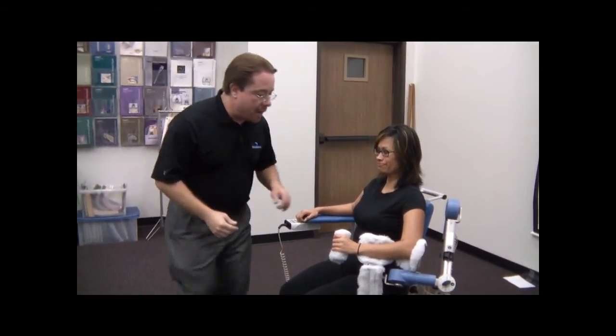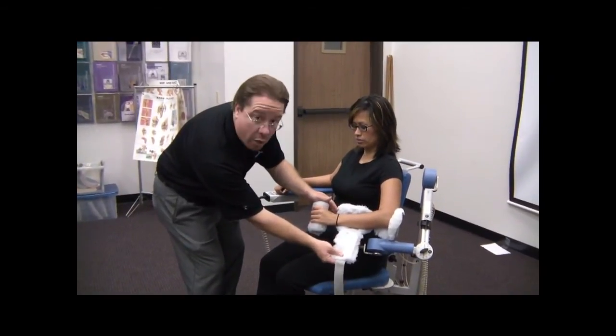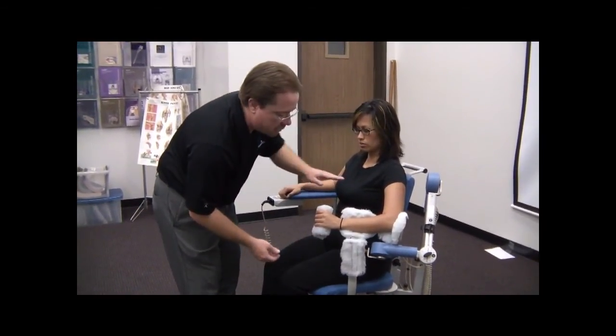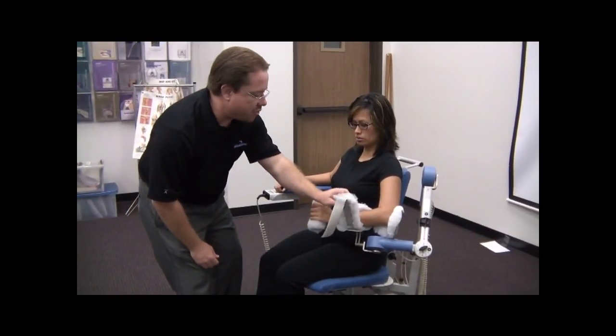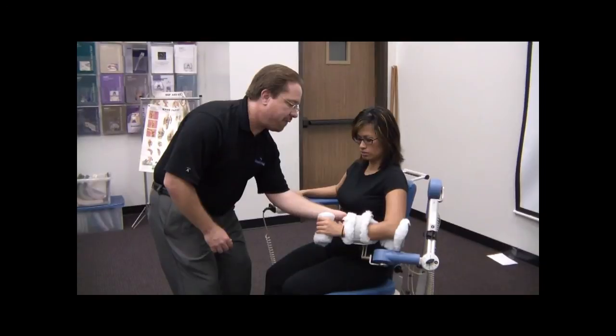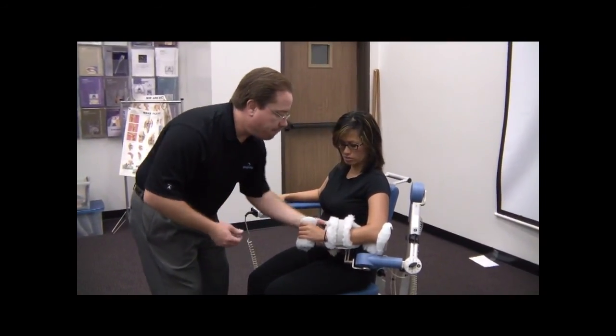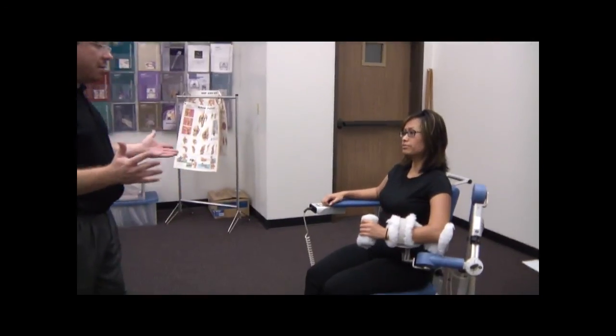So we're going to go ahead and explain to the patient that they do need to wear this strap. It's going to help hold them into place so they can reach with the off arm, they can grab that strap, and then they can just touch it to the Velcro, and they can leave a flap to grab for it when they want to get out, okay? So we look good here.